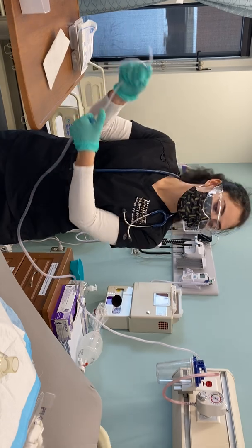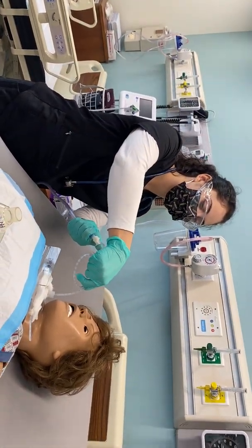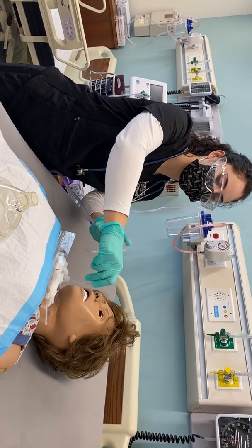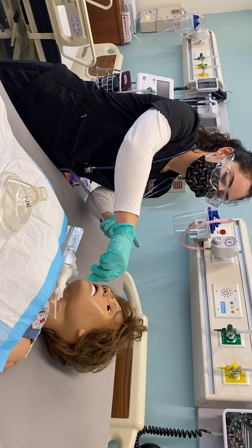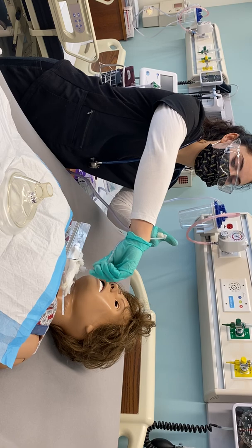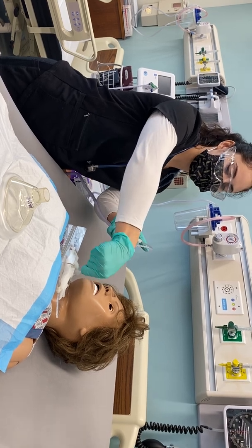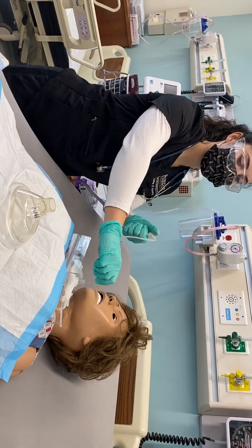All right. Now I'm going to place this tube in here at a predetermined length. Okay. I'm not going to be occluding as I'm putting it in. I'm just putting my thumb to the side over here. Okay. All right, now I'm just going to rotate it. And, okay. Still okay, Mr. Jackson? If you are not, please raise your hand. Okay, so Mr. Jackson's still doing okay. So now I'm just going to take it out as well.